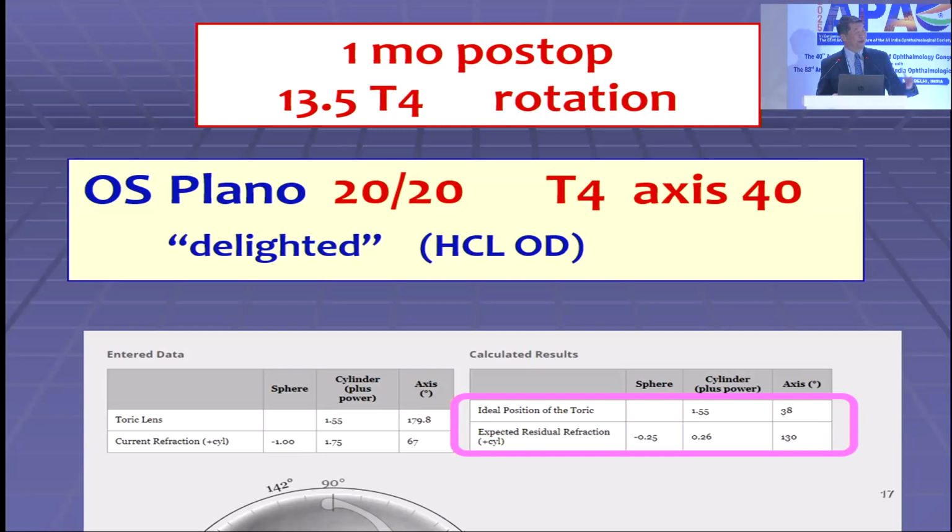It's another doctor in Northern California. Maybe there was some problem with the original surgery. Yes. But that wasn't part of the referral letter, and in fact, it was referred for the other eye. Yes, exactly. Now, what do you think happened in this case?